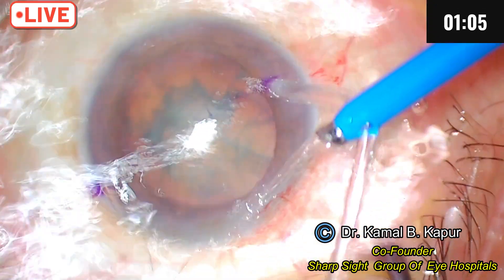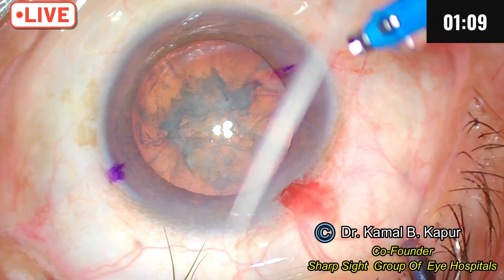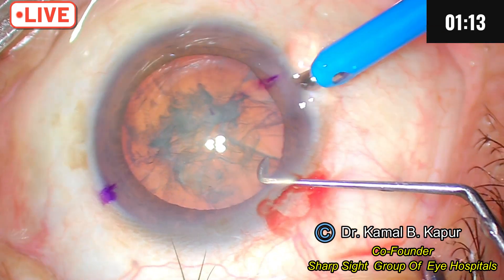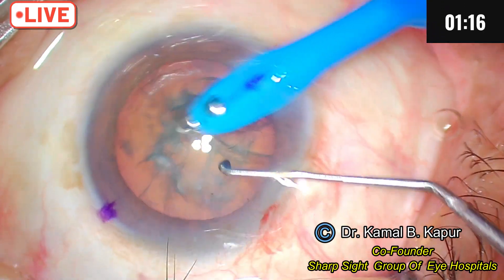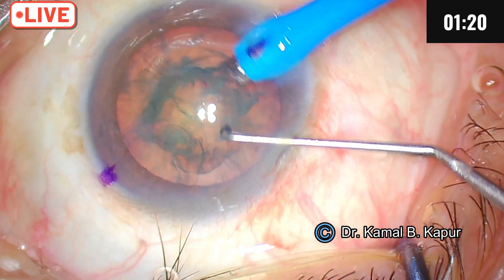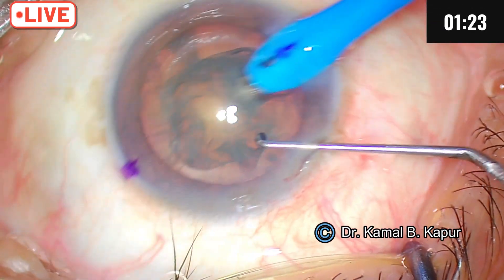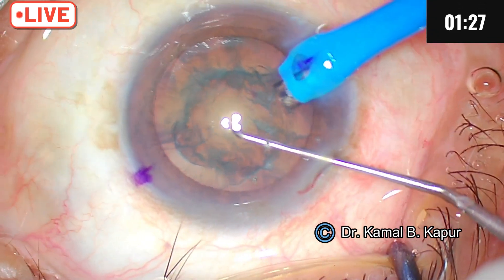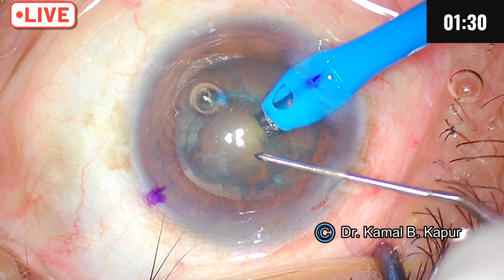When you are doing a soft cataract, make sure that the tip exposure is not very high, because in a soft cataract you can have these issues. When operating a soft cataract, try and remove the floating cortex on top — that gives you a very clear estimation so we can assess whether we have the right phaco power set or not.